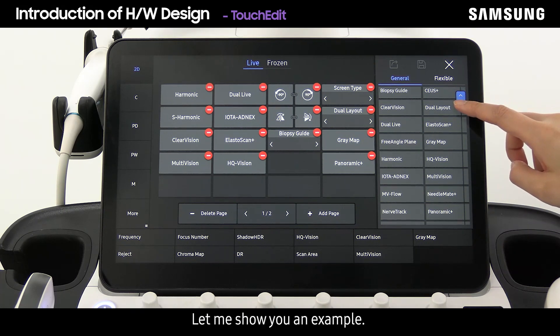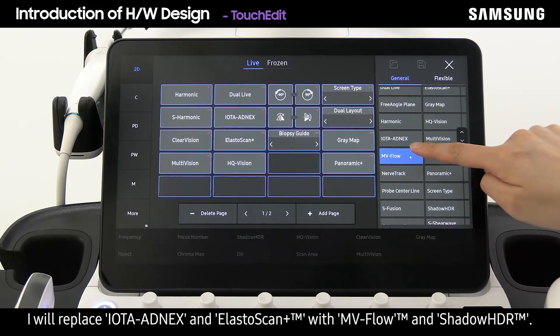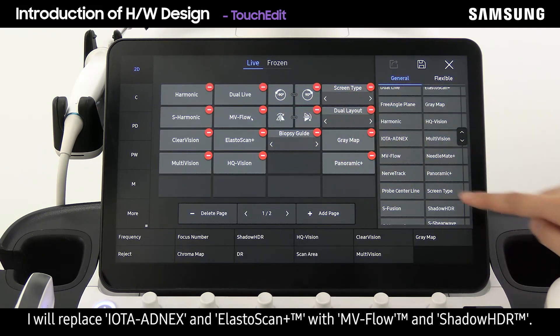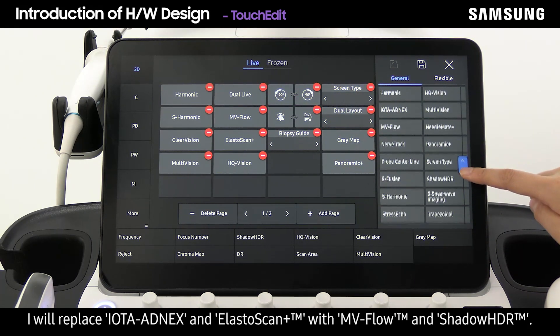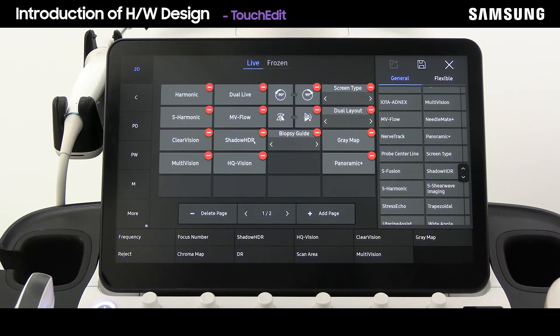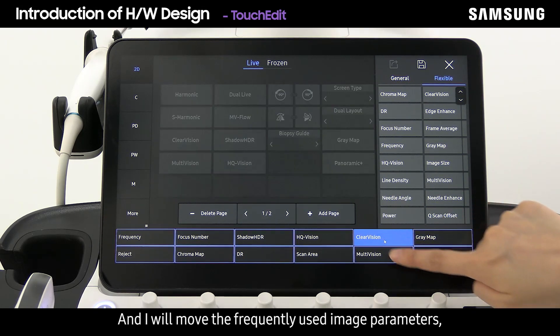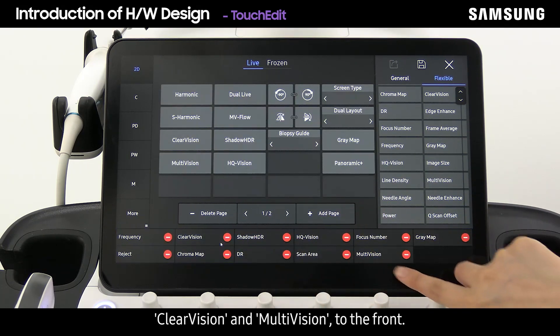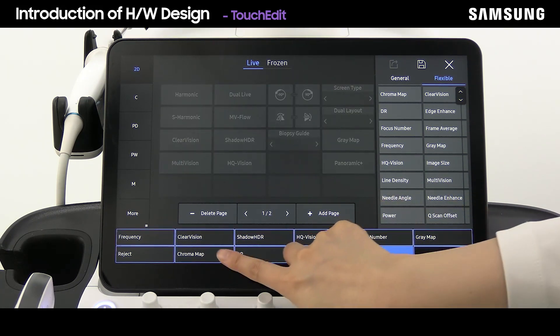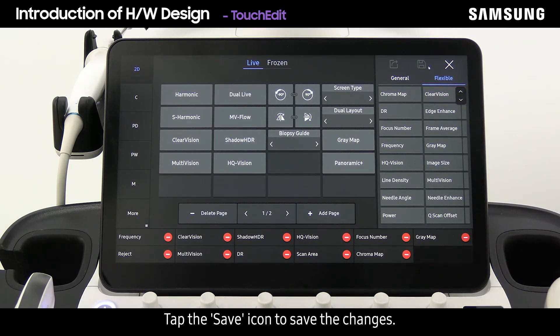For example, I will replace IOTA-ADNEX and Elasto Scan Plus with MV Flow and Shadow HDR, and move the frequently used image parameters Clear Vision and Multi-Vision to the front. Then tap the save icon to save the changes.